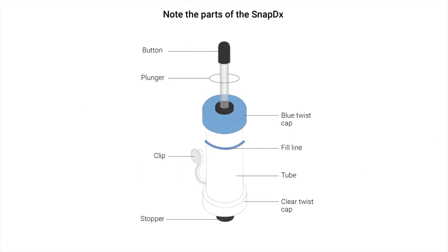Let's take a minute and note the different parts of the SnapDx. Here you'll see the tube, the blue twist cap, the clear twist cap, the fill line, the clip, the plunger, the stopper, and the button.